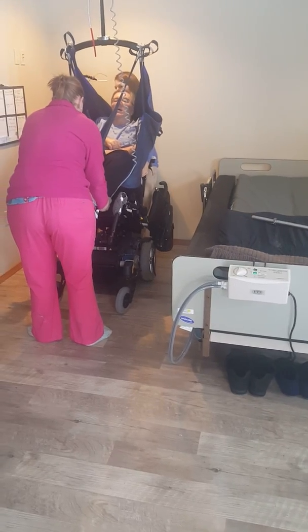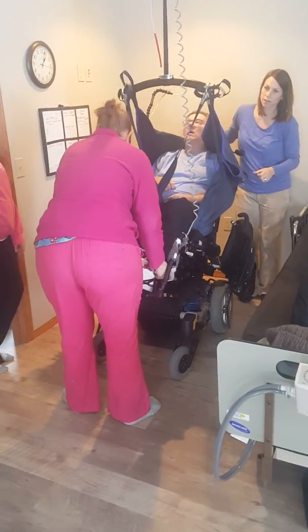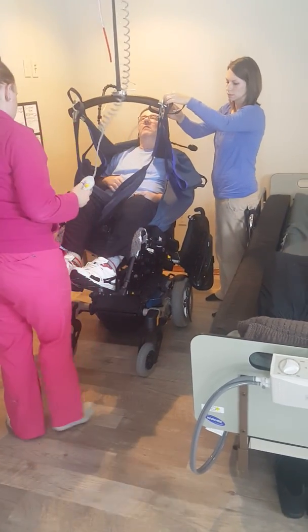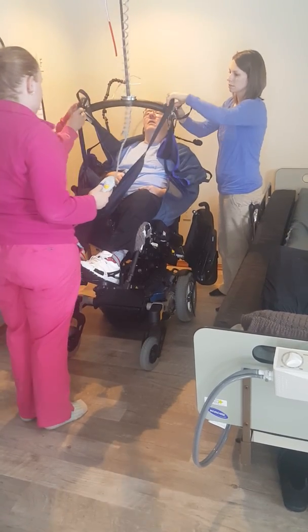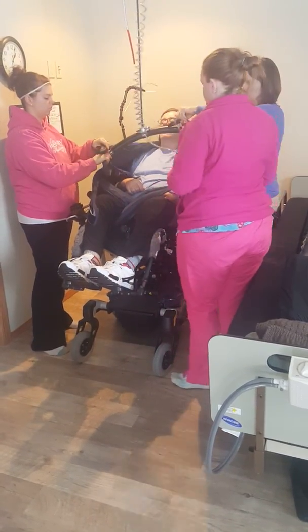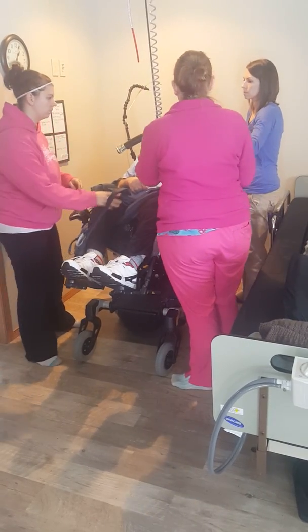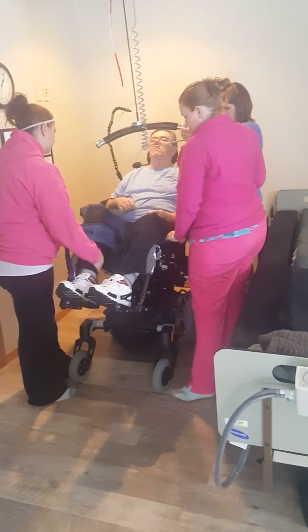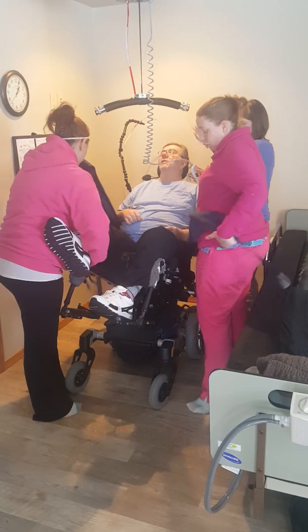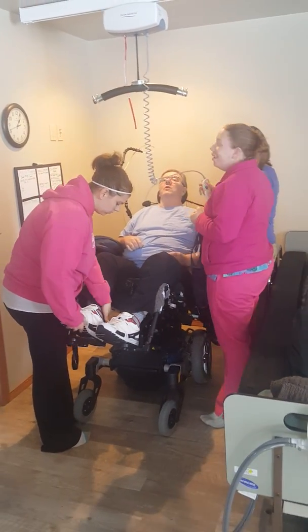It's supposed to be more comfortable. An easy way to remember that is small, medium, and large. We're going medium, medium — small, medium, medium. We found that gets me up and down a little more straight. I've seen you kind of hang on with your head back. Medium, medium, large — medium, medium, small — small, medium, medium. No, we're only one gray.